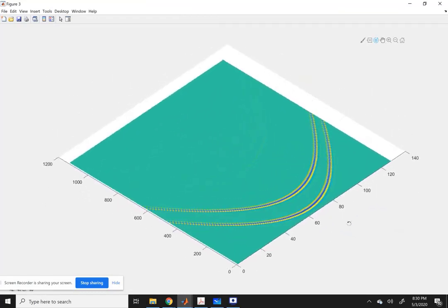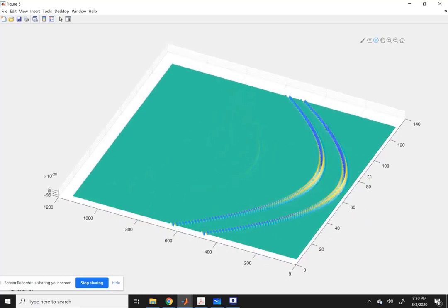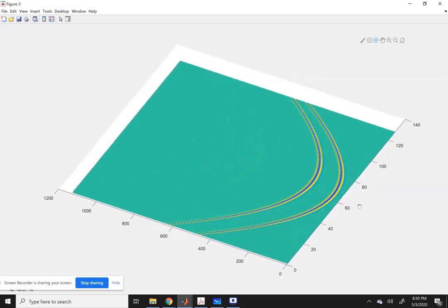Okay, so you can see although there are just 2 points which were simulated, the transducer is sitting on this side. This is only showing value from the start point onwards. So the first point is somewhere here, the second point is somewhere here, and this point is about 24 millimeters away from the transducer. And because of that, you see these do not look like single points, they look like a complete bow waveform.